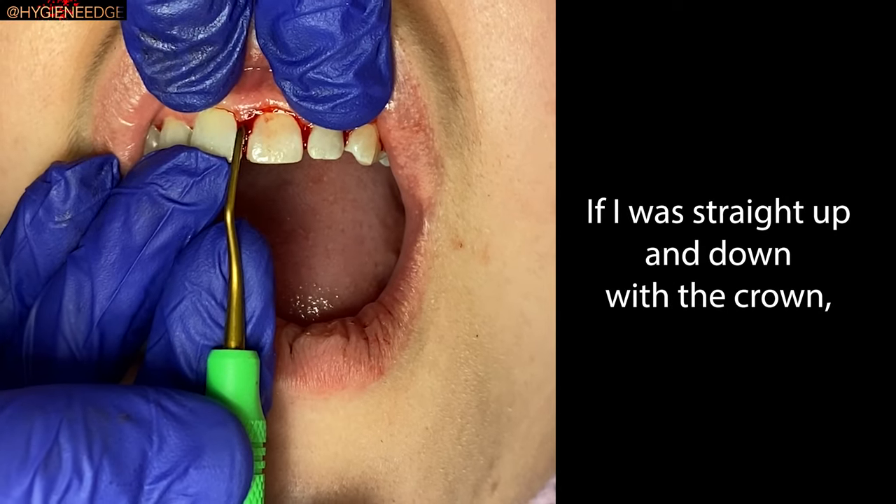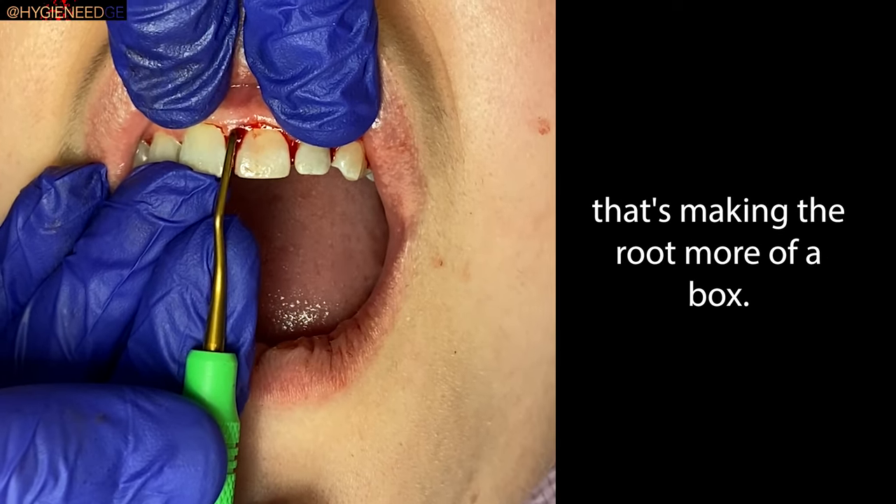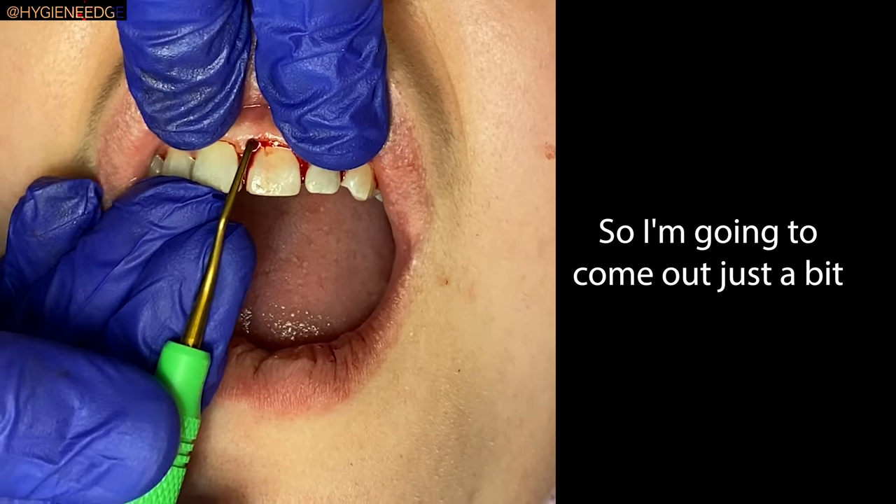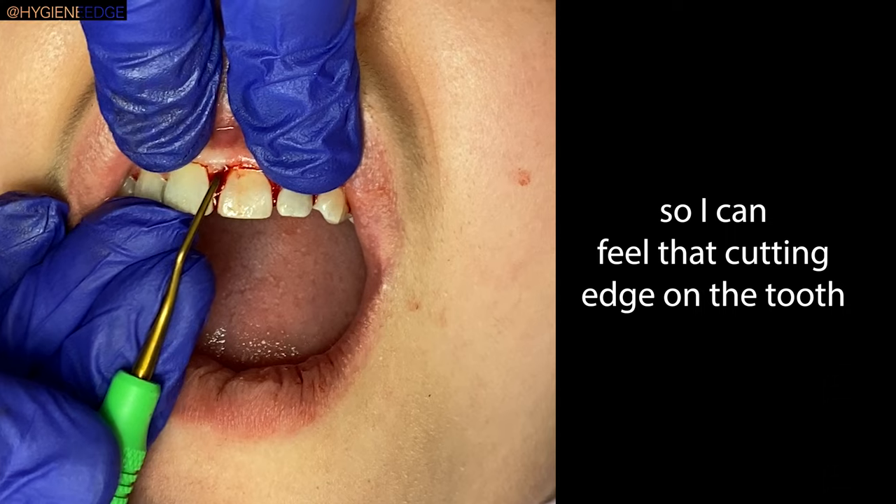If I was straight up and down with the crown, that's making the root more of a box shape. So I'm going to come out just a bit so I can feel that cutting edge on the tooth.